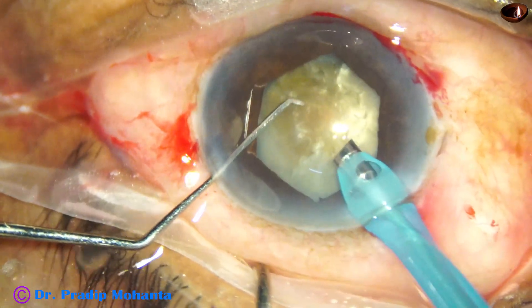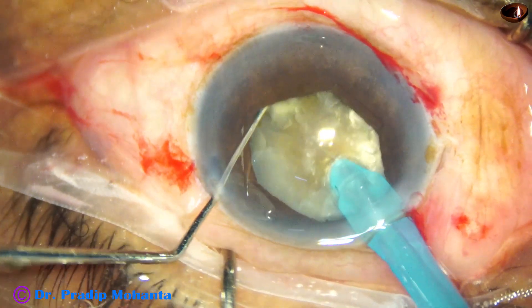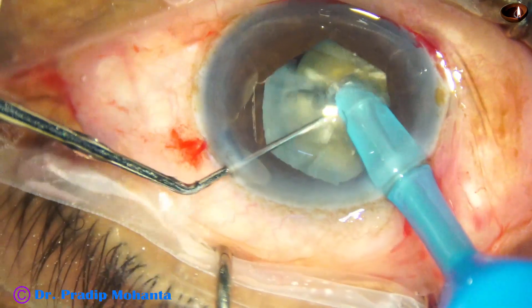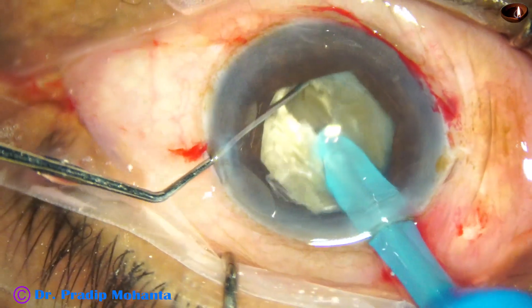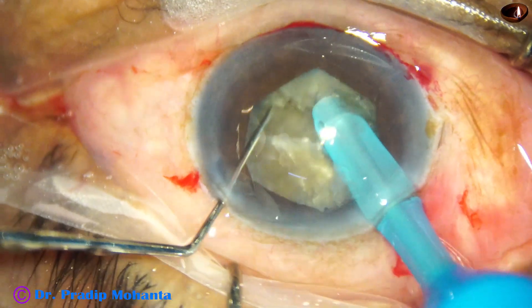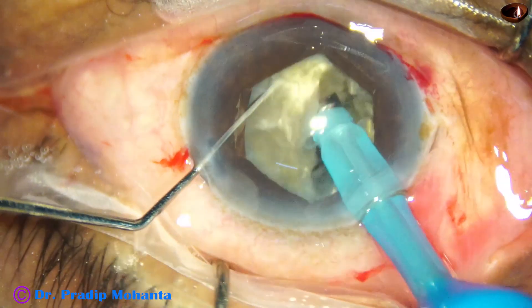The handpiece is turned to make the bevel up. The tip is buried in the substance of the nucleus and goes through the substance of the nucleus. As it reaches near the opposite equator, the chopper is used to make a good crack and a nice separation is done. We come to the other side to sculpt and go to a deeper plane, hold one hemi-nucleus and separate the other. So we have got two hemi-nuclei.